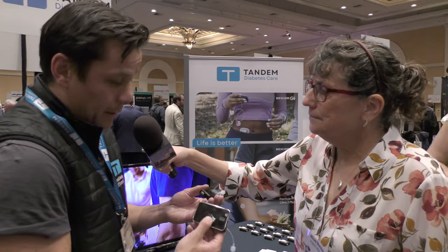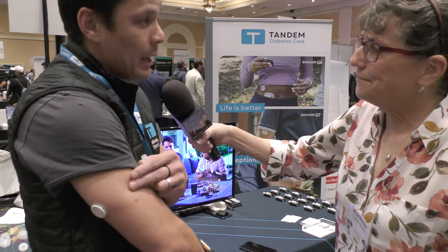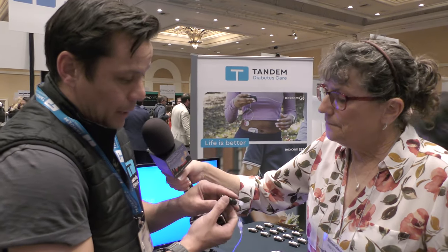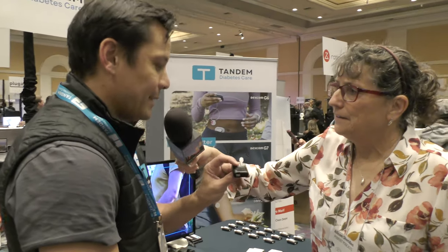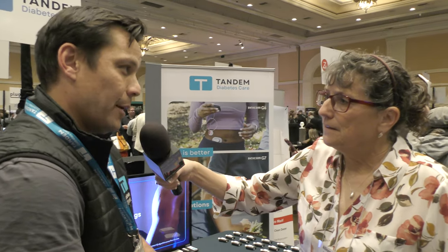Dorothy asked whether you'll be able to update the firmware on the Moby. Absolutely — one of the unique things about Tandem pumps is you can actually update the software. Both pumps will be completely software-updatable, and the unique thing about the Moby is there are no ports on it, so it's completely wirelessly updated via a compatible mobile app. That's why they can make it so small — it's controlled by a mobile app, though it's still physically connected to you for insulin delivery.